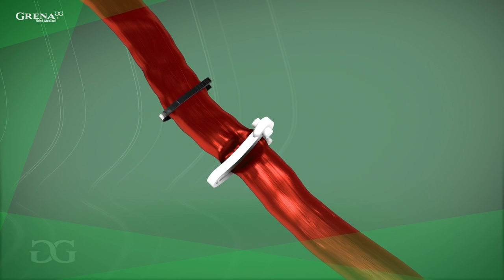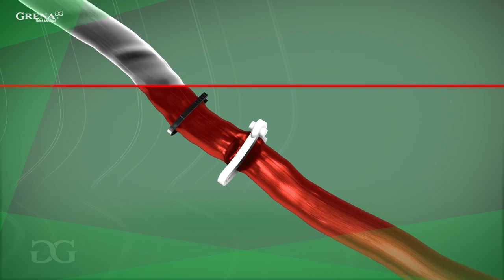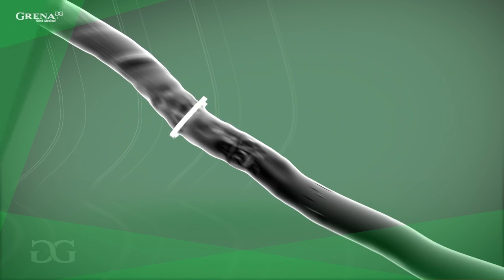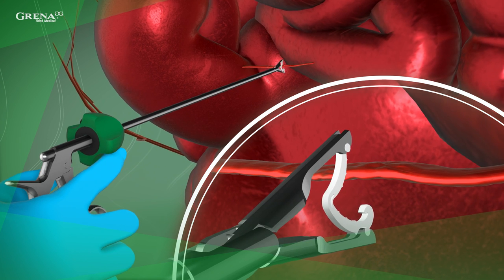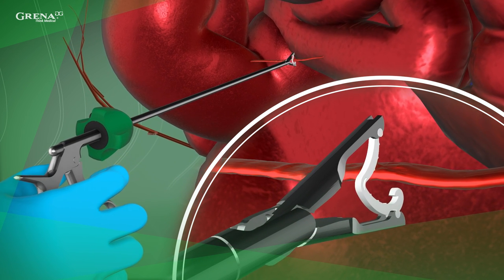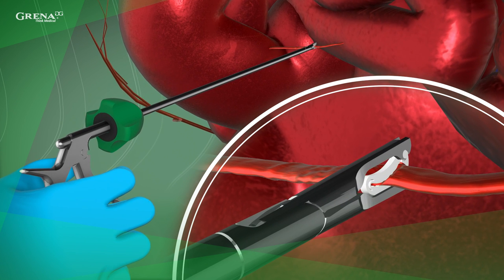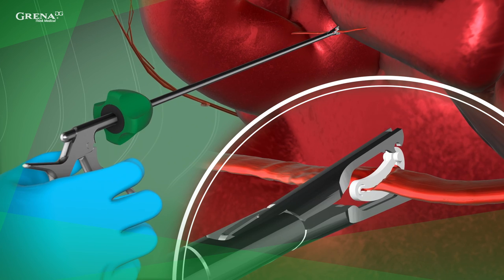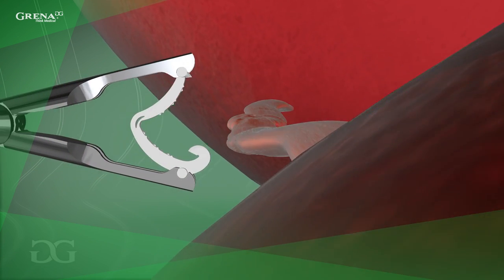We recommend polymer clips as opposed to titanium ones because they don't interfere with CT and MRI imaging, providing a higher level of safety. During the application, rotate the endo-applier shaft so that the single tooth of the clip will go down and can be seen from the top and side at a time. This allows the user to visually confirm encapsulation of the structure being ligated. When applying the clip, the closing of the clip has to be visible to the operator.